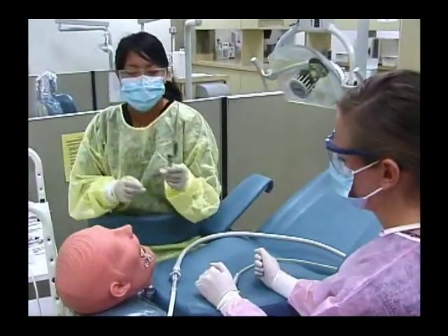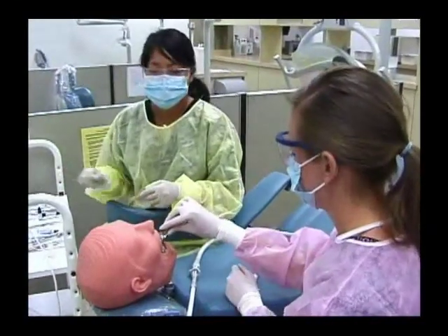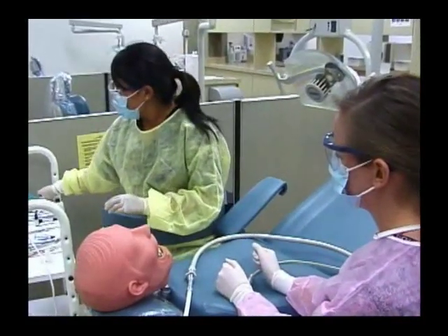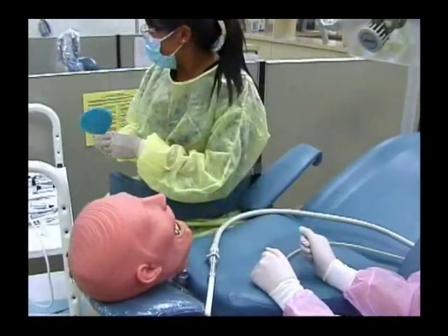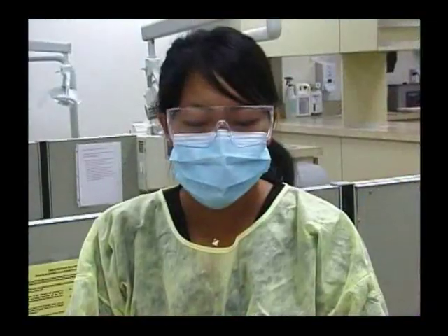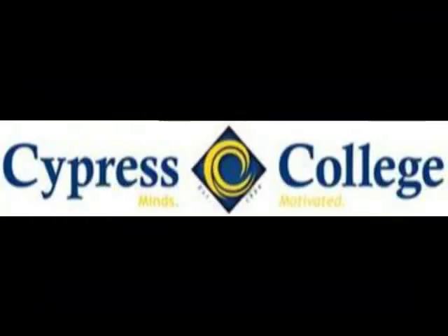Then I'll give her articulating paper so she can check the bite. And if everything is okay, we'll show the patient the tooth — the final restoration. That's the end of the composite procedure. Once we've practiced to proficiency, our teachers give us checkoffs for each procedure. Thank you.